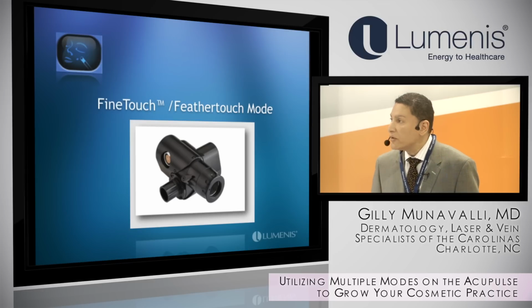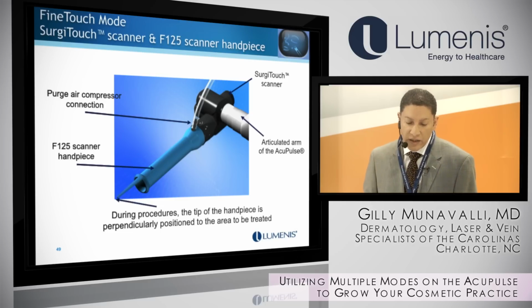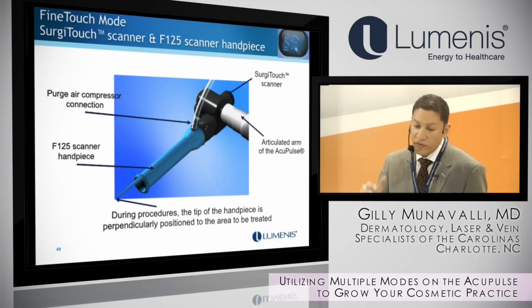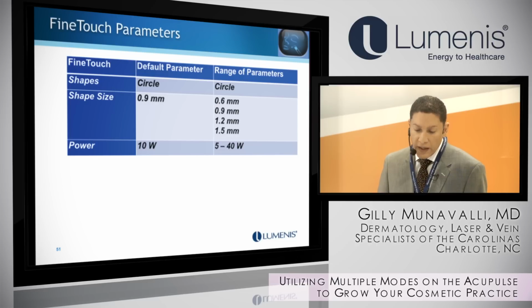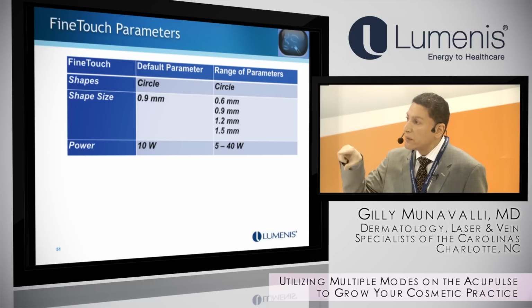So the fine touch, feather touch mode, I use the feather touch mode, and I'll show you the indications here. It depends on the handpiece. You can use the F125 or the larger handpiece if you're treating a spot versus a full face. Remember, this is a fully ablative procedure, so you're getting really nice contraction. The healing is a little bit more. You can do smaller spot size, or with the larger handpiece, you get a bigger pattern.